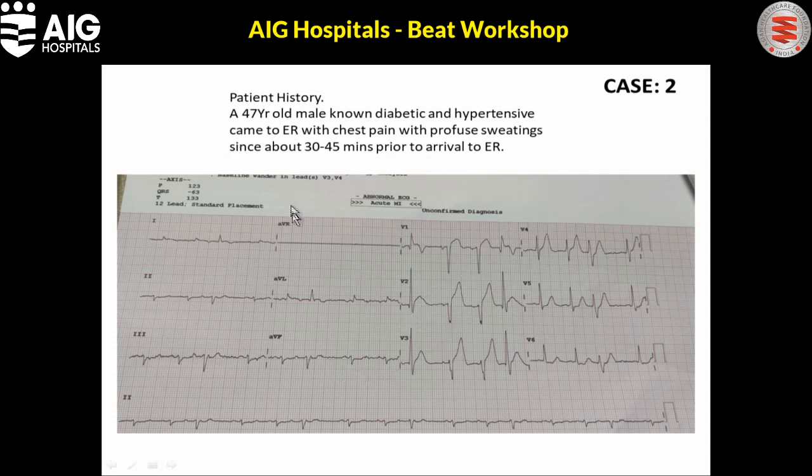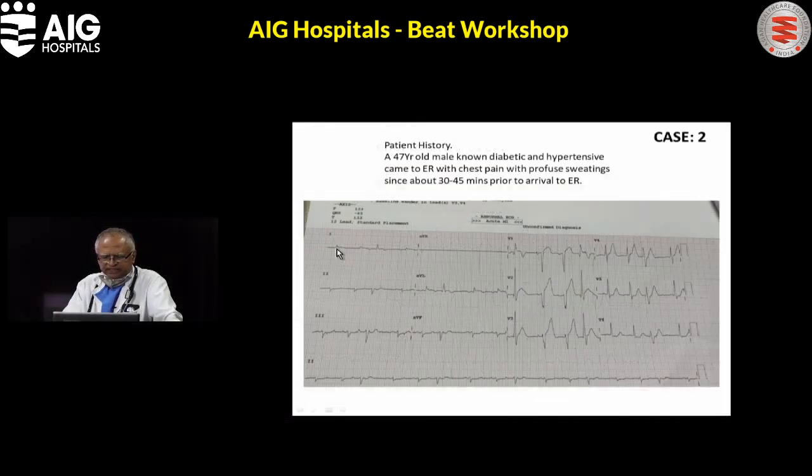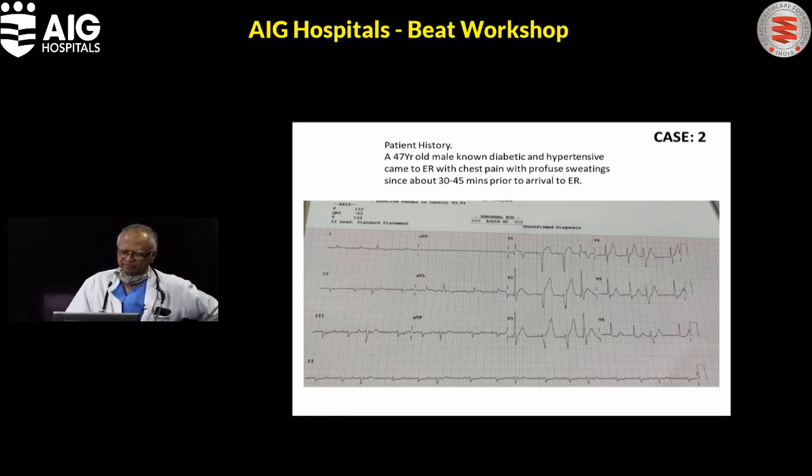We'd be interested to know the clinical details, but this needs to be treated as an acute coronary syndrome. You need to repeat an ECG after a couple of hours to find out whether there is an acute myocardial infarction. And the telltale sign is this QR in V1 during a PVC, which unmasks the old myocardial infarction.